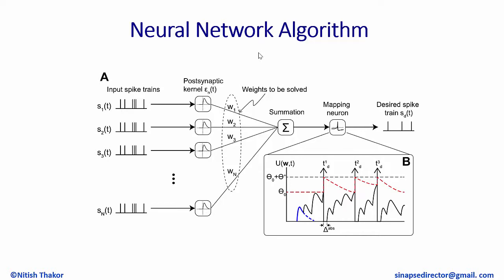It's a technique called address event encoding, which means you can give an address of where the source of the signal is, and it produces spiking activity. So there are a lot of advantages to doing it in a biomimetic way. We get different types of sensors and different types of encoding of the information.